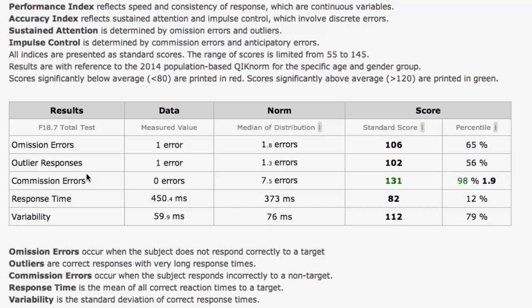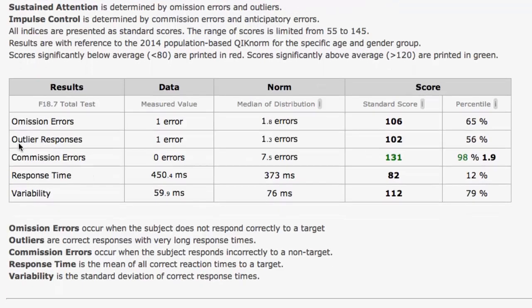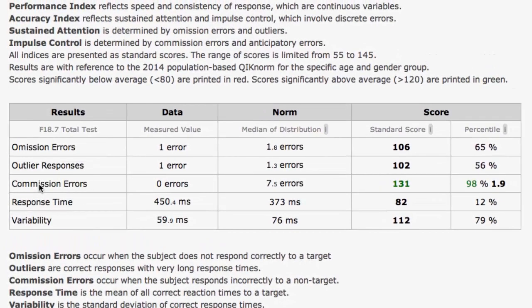These measures are familiar from the last test, with the addition of outlier responses — outliers are an addition here. But they correlate with the omissions, so that is similar data that you're familiar with. Then we have commissions — pressing when you were not supposed to press. Response time is how fast you pressed, and we want to see that lower — the faster, the better. The goal of the test is to be both fast and accurate.